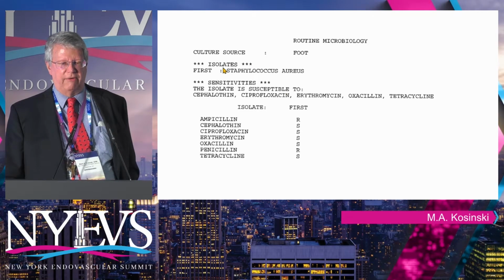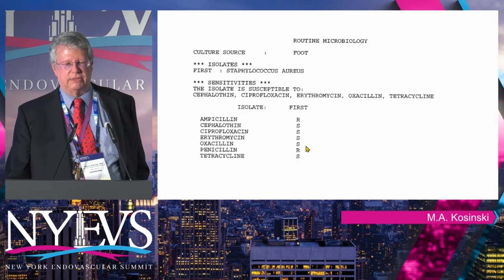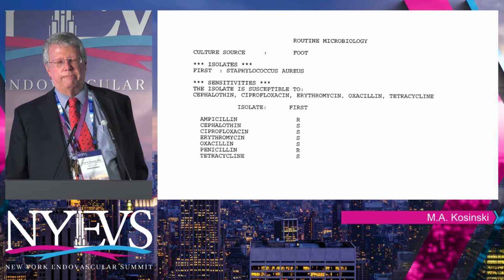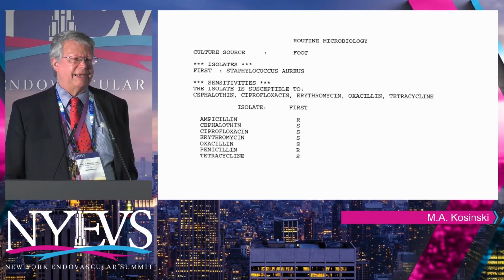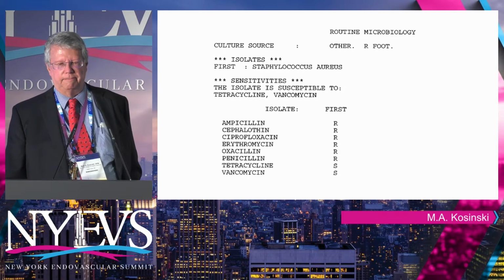antibiotics are not beta-lactamase stable. And again, we look at Staph aureus, we go right to oxacillin. If it's oxacillin sensitive, it's MSSA. If it's oxacillin resistant, it's MRSA. So this is representative of the maybe 90% of the staph that you and I are going to see in treating skin and bone infections.